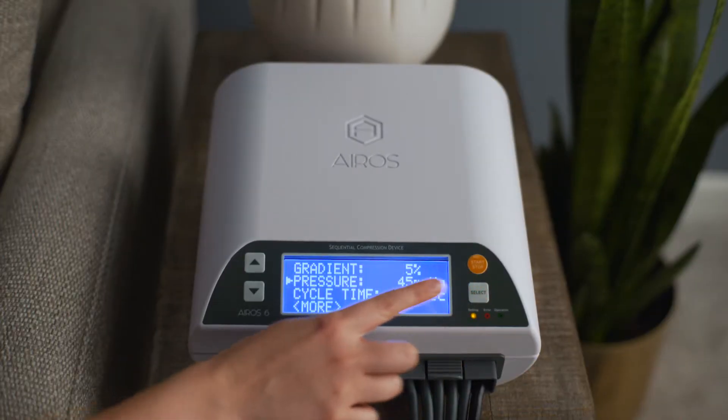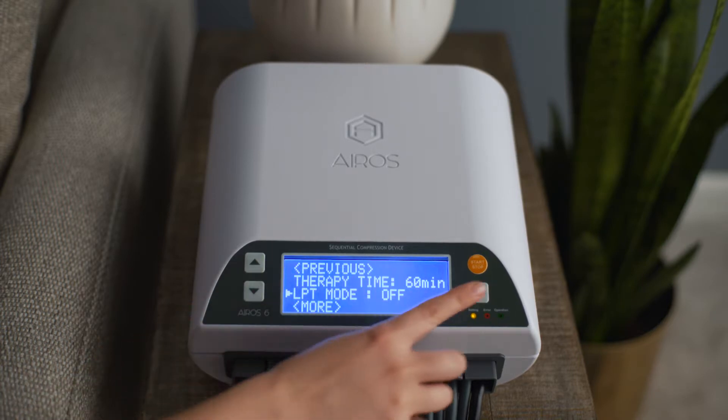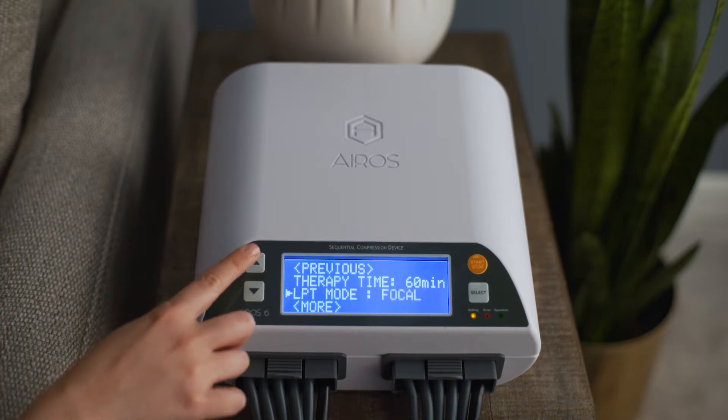To operate the device with focal mode, from the gradient mode setup screen, scroll down to LPT mode and press the select button. Scroll to focal and press the select button.